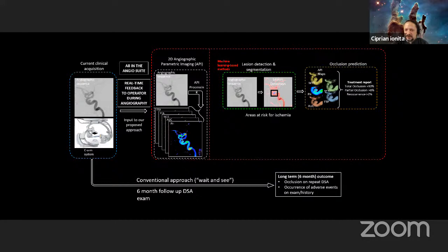A 52% confidence in a prediction is not the same as 90% confidence. So it is good for us to break the AI down and show the surgeons how confident the software is, and display it in our interpretation of the predictions.